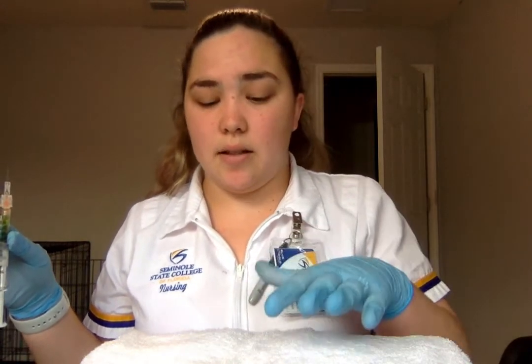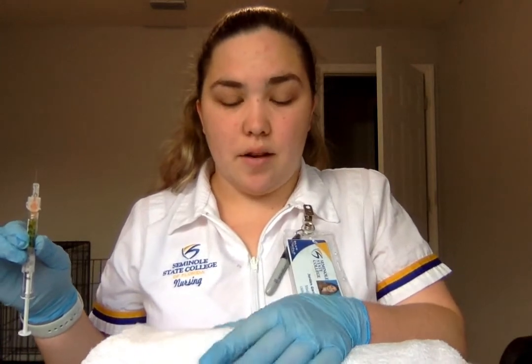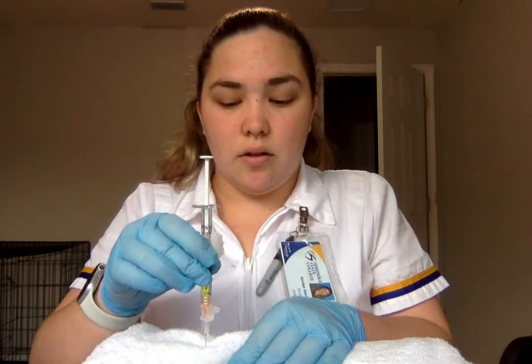And for the subcutaneous injection, we're going to pinch the skin this time. So I'm going to pinch a section of her abdomen right there by her umbilicus, 2 inches away. Pinch it nice and good, to get that fat. I'm going to go in at a 90-degree angle again, like a dart motion, quickly.